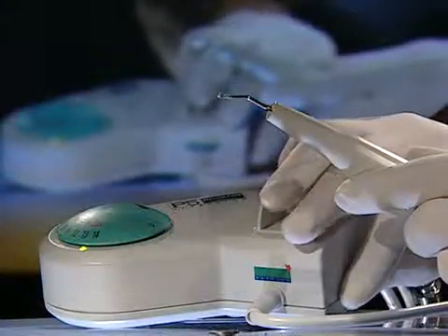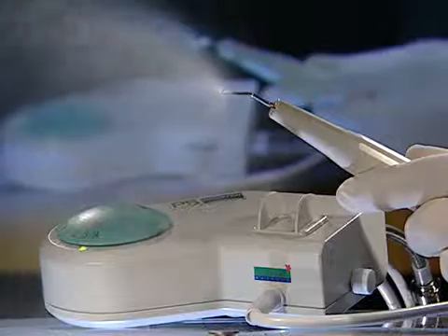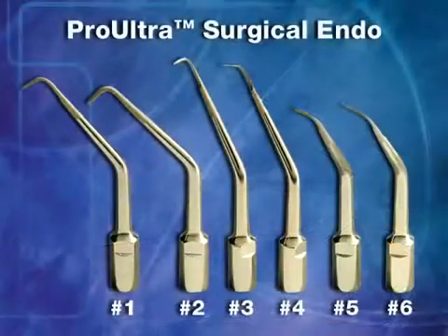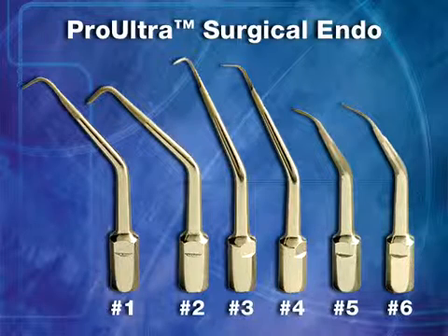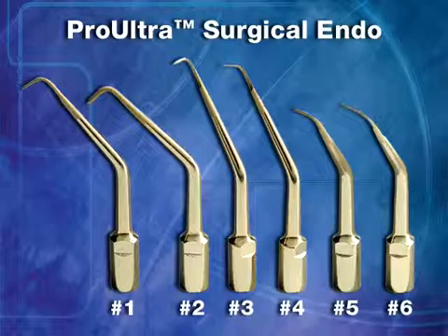The Pro-Ultra Surgical Instruments feature an improved irrigation port strategically placed at the front of the tip for increased efficiency. There are a variety of shaft and tip angles. These are also slightly longer than other microsurgical instruments to improve visibility and access.